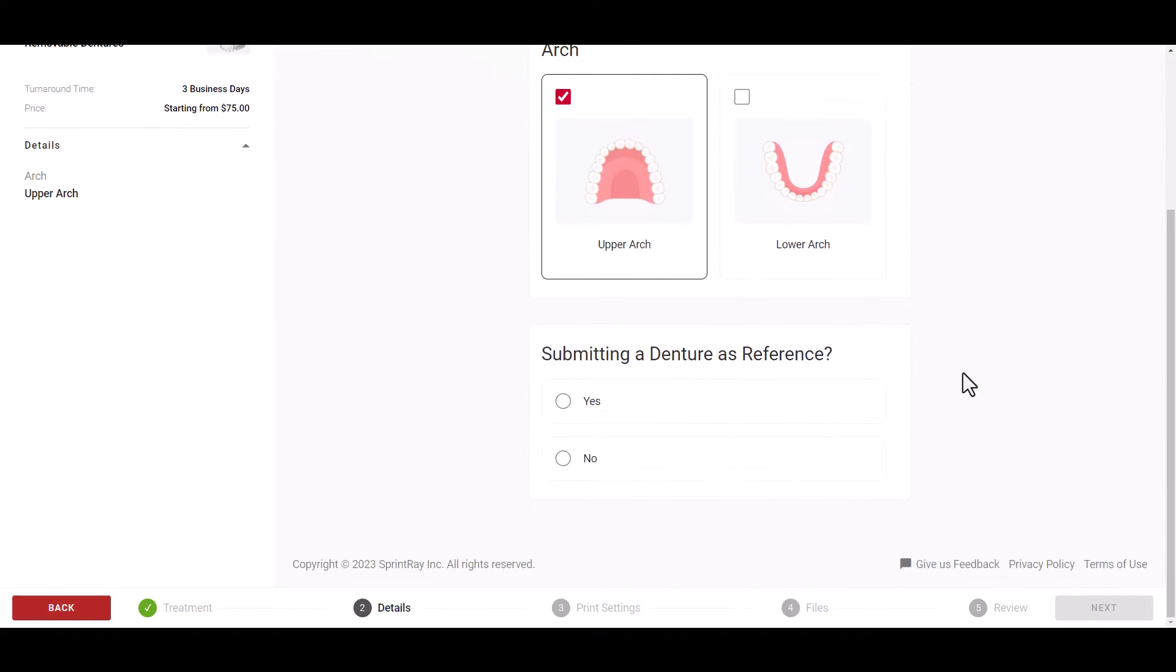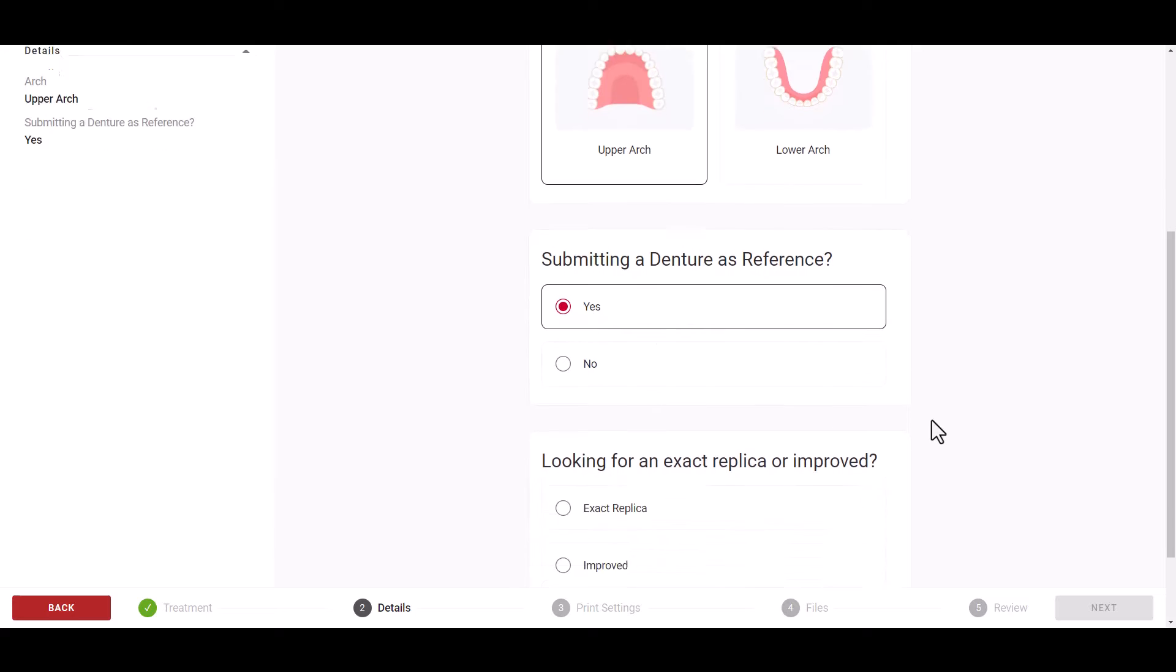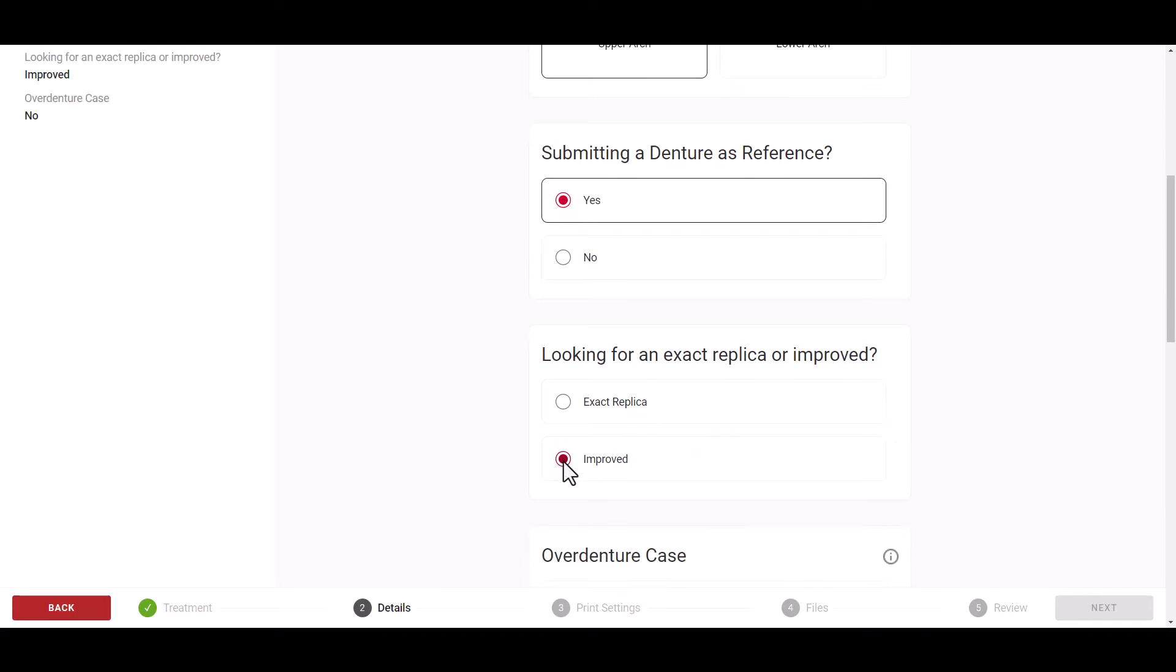In this example, we will be using a reference denture and creating an improved design. Please note that exact replicas will not have the ability to modify the aesthetics.